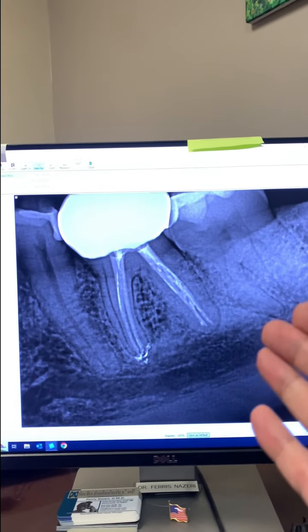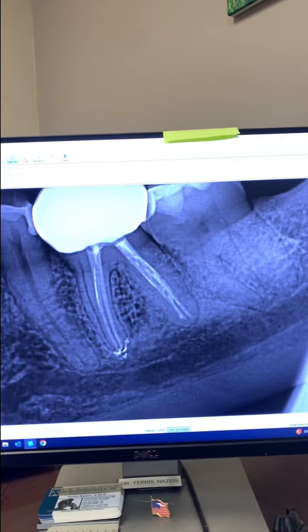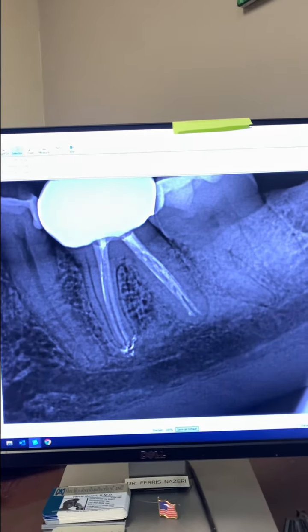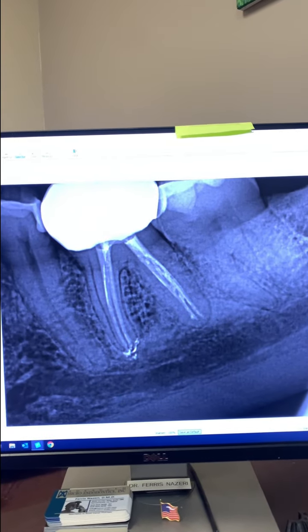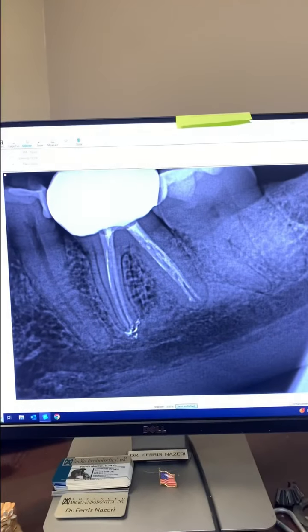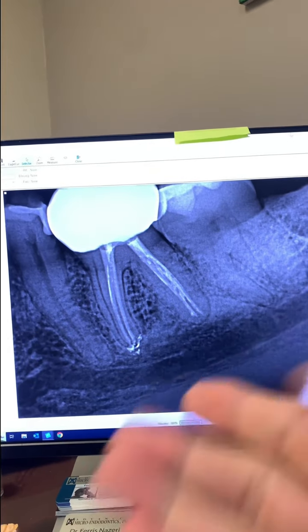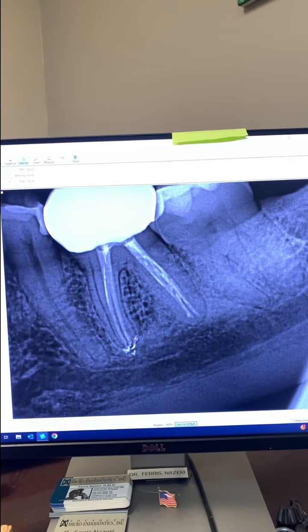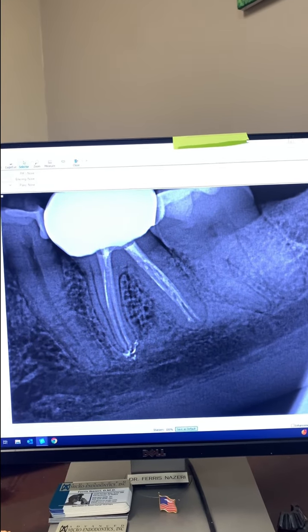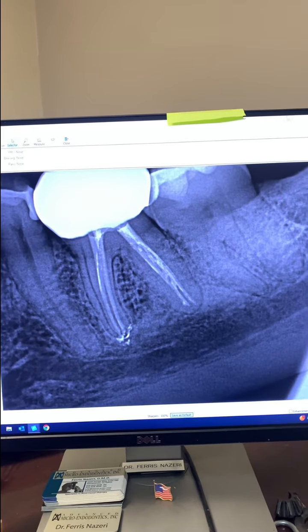And there you go, 2 years post-op of tooth number 19. Again, tooth has a crown on it, as you can see, in full function. So 1 appointment endodontic treatment works. Sealer extrusion does not cause endodontic failure. And again, here's the date, today's date. So 2 years post-op of tooth number 19, 1 appointment endodontic treatment with some sealer extrusion that did not cause any issues for the patient. So here you go. Example 5,000 plus.